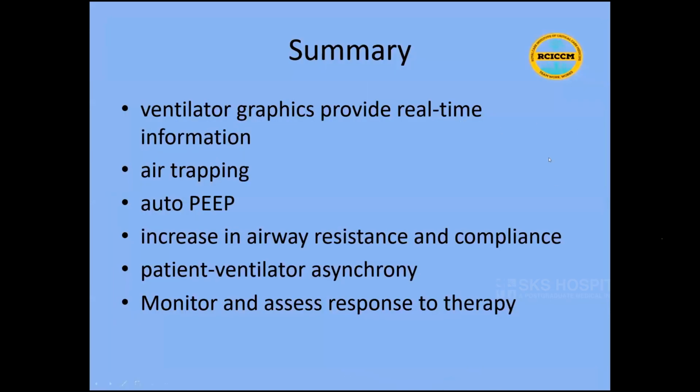So just to summarize, ventilator graphics can provide real-time information, and pathologies like air trapping, auto-PEEP can easily be ascertained by the bedside along with the clinical picture. And if there is an increase in airway resistance or decrease in compliance, or subsequently contributing to the patient ventilator asynchrony, which will be dealt with later today, all these factors can be ascertained by the bedside using these scalars.